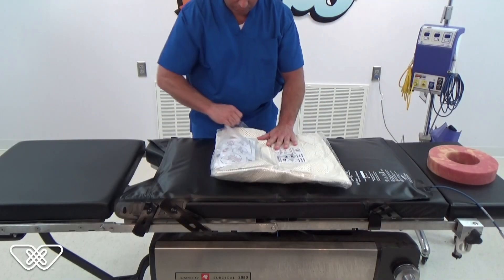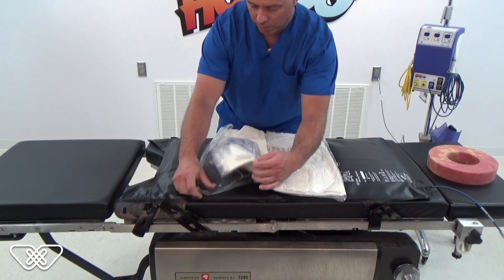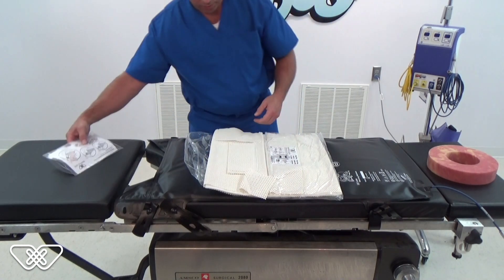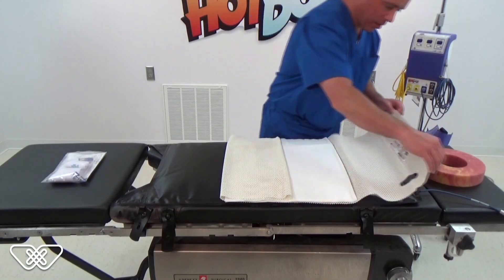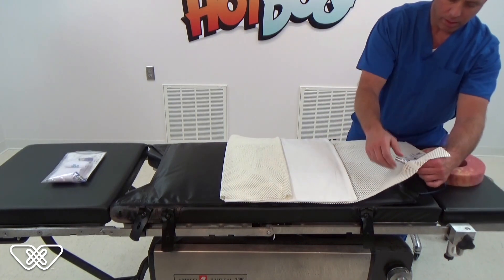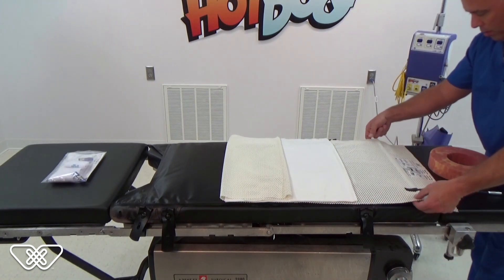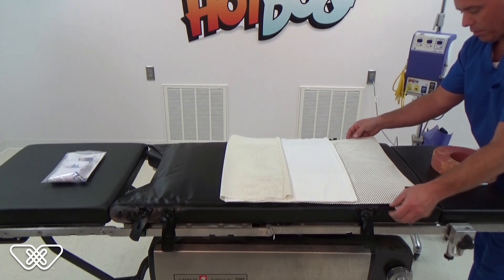Once the mattress is secured to the operating table, it is time to set up Waffle Grip. Remove the contents of the Waffle Grip kit from the plastic packaging. Place the smaller plastic bag of components off to the side for later use. Position the kit flat on the U300 warming mattress as indicated on the printed diagram. Unfold the Waffle Grip pad over the warming mattress. Thread the blue power entry cable through the hole on the pad.